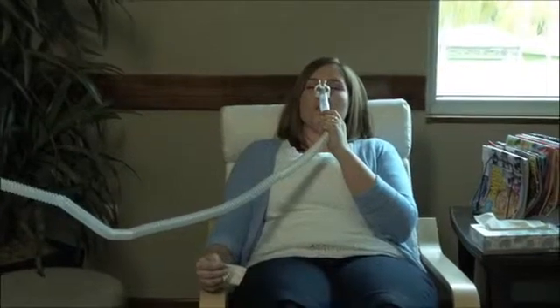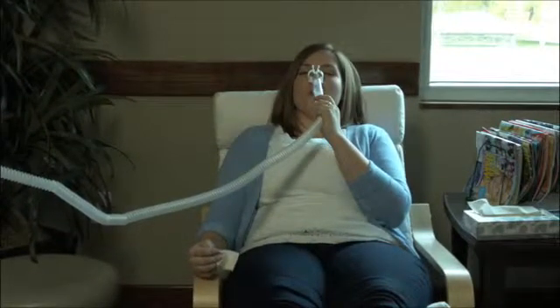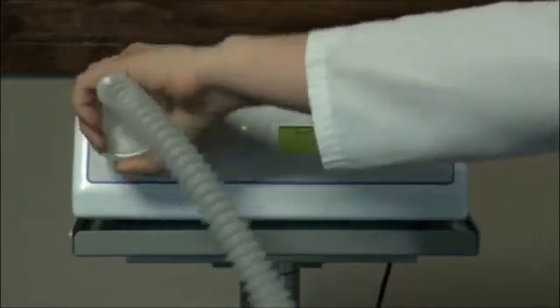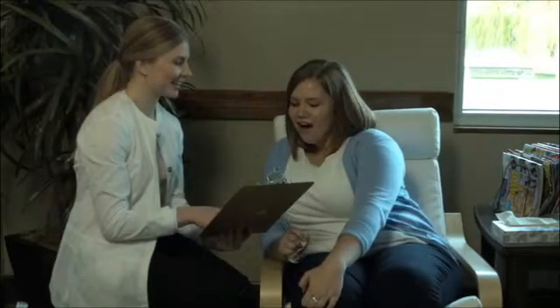The average length is 10 minutes, but it can take longer for patients who struggle to relax. When the test is complete, the Review will beep. You simply dispose of the metabreather mouthpiece, enter in some basic data, and the results are ready to print. You will then be able to customize your patient's calorie goal depending on where they are in the weight loss process. That's metabolic testing with the Review — it's quick, easy, and anybody in the office can do it.